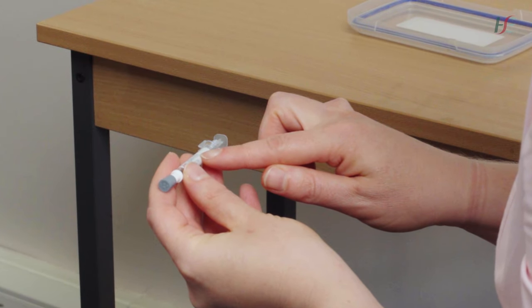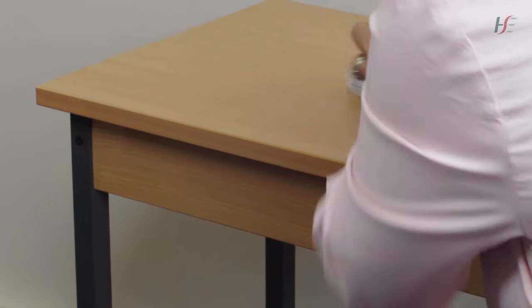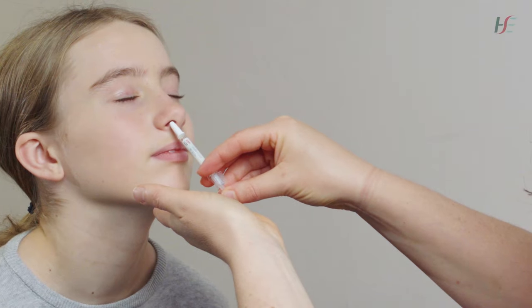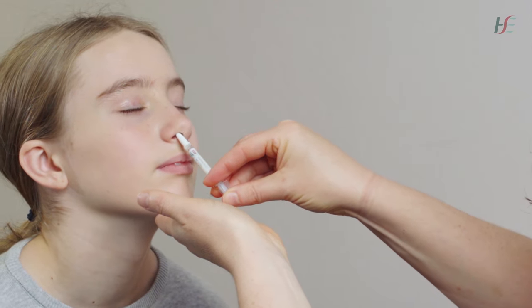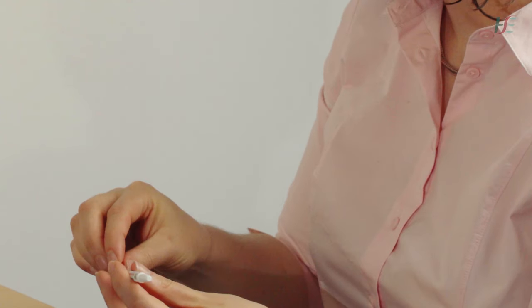Do not remove the dose divider clip at the other end of the applicator at this stage. Remove the applicator's rubber tip protector. With the child in an upright sitting position and their head slightly tilted backwards, place the tip of the applicator just inside the right nostril. Push the applicator with a single motion as quickly as possible to administer 0.1 mL of vaccine until the dose divider clip prevents you from going any further.